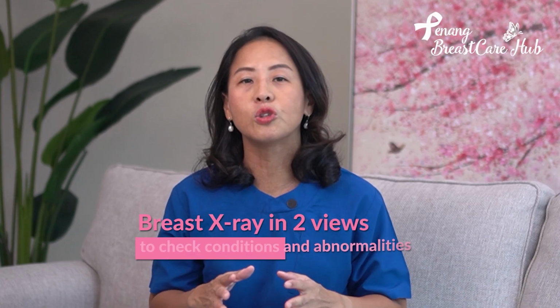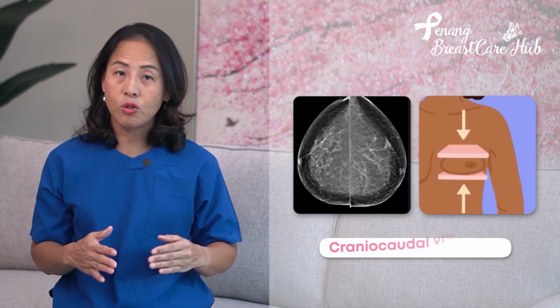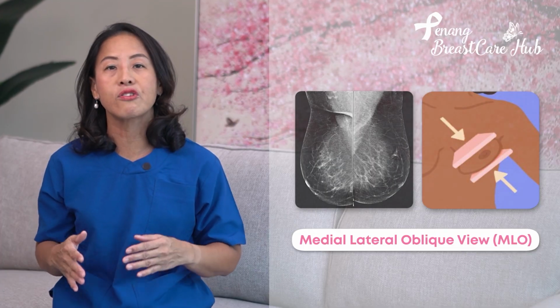It is an X-ray examination of the breast taken in two views to detect and diagnose breast conditions as well as abnormalities. The two views of mammogram that are used are the CC view, or the cranial-caudal view, or the MLO view, which is the medial lateral oblique view.